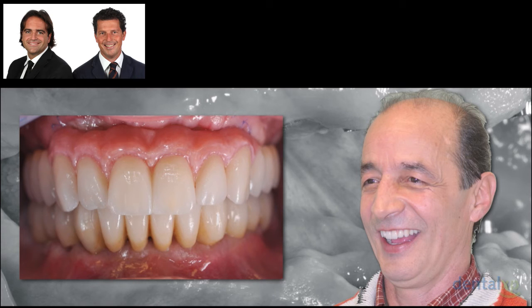We want a surgery that is as atraumatic as possible, because this is how we want to see the patient 24 hours after the surgery, smiling with his nice provisional in place, with no bruises, with no swelling. Because, as I was telling you, the modern treatment plan approach has to have in mind the patient and the quality of life of the patient also during the treatment plan sequence.